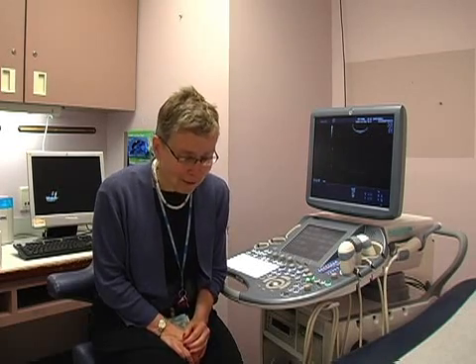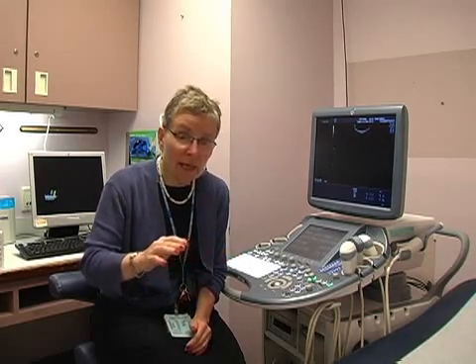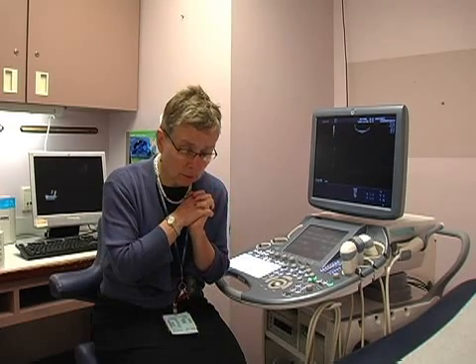Because the pregnant abdomen is a very large surface area, it's very important to use a sufficient amount of gel — and that's a lot of gel. You're going to need to have enough gel that no matter where you go on the abdomen, there is gel between the ultrasound probe and the patient's abdomen, because any air that gets into that interface is going to interfere with the quality of your image.